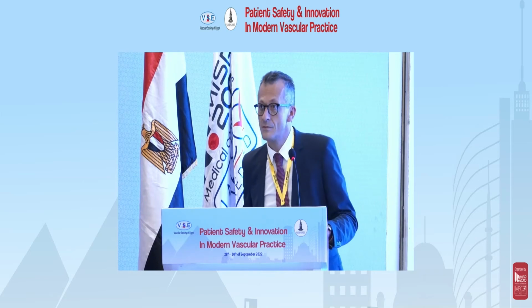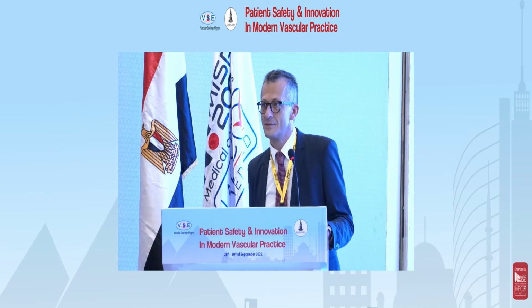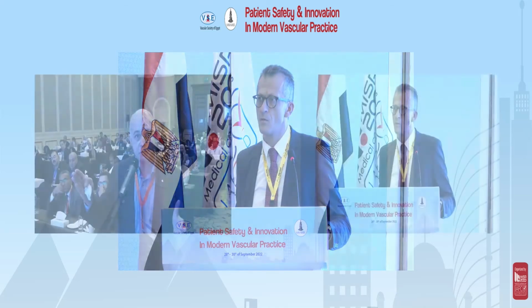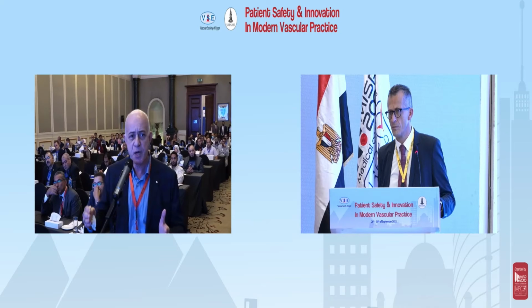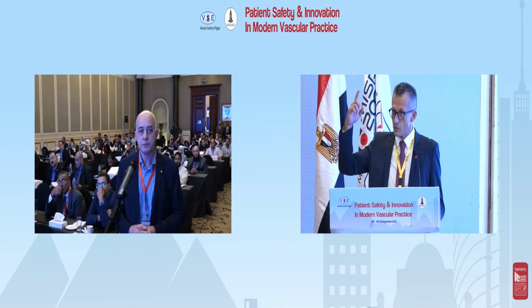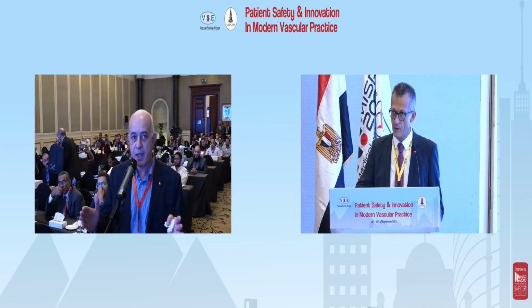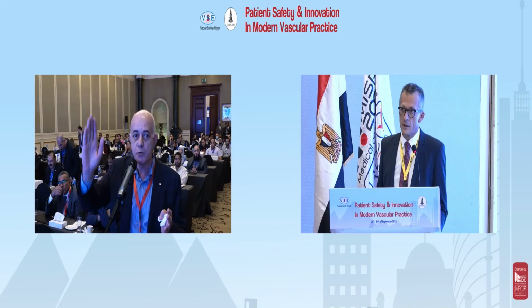Excuse me, Dr. Bruno. Go, Dr. Mata. We have to go with the Rotarex with the bloodstream, but in the last case you presented, the occlusion, it was against the bloodstream. You came from below and went upwards. Can you elaborate on this, please? You went from distal to proximal, against the flow of the blood.